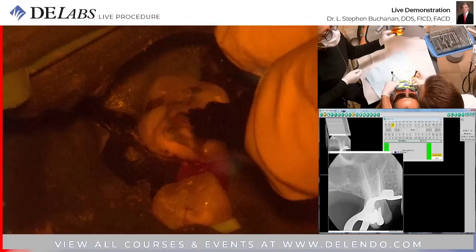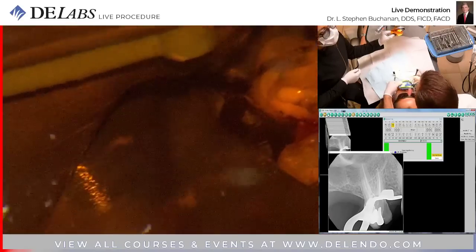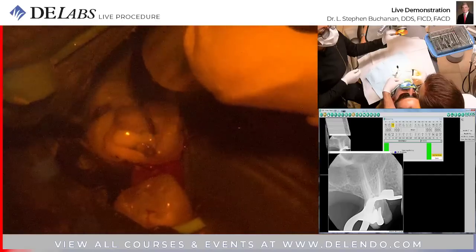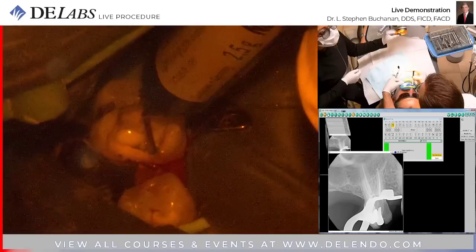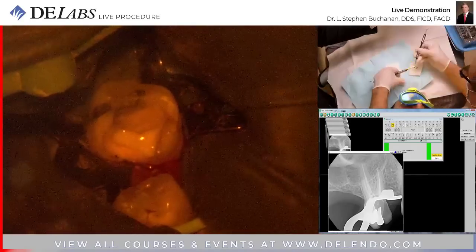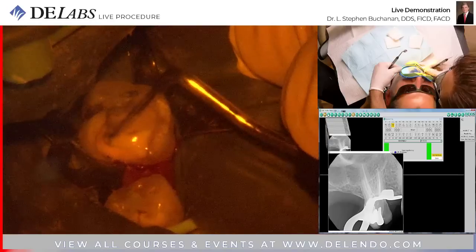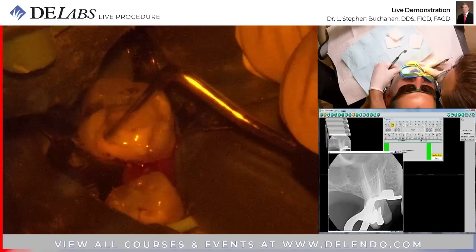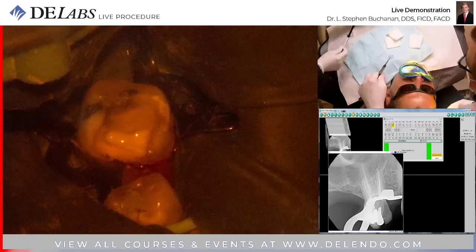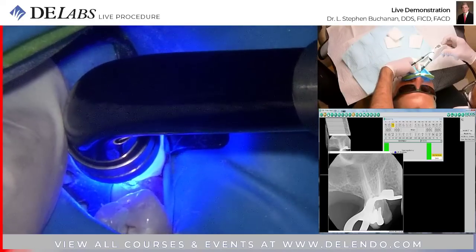This is the Voco glass ionomer that's flowable. I got super frustrated with the handling characteristics of Fuji. I found it to be really difficult to put in place without stringing up and creating a void. This way, no matter what happens coronally, I know that I'm going to have the root canal system sealed up. Put a little sponge in there and some Cavit.